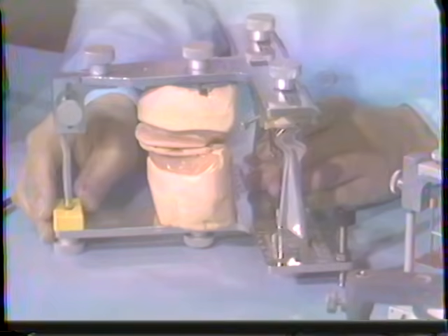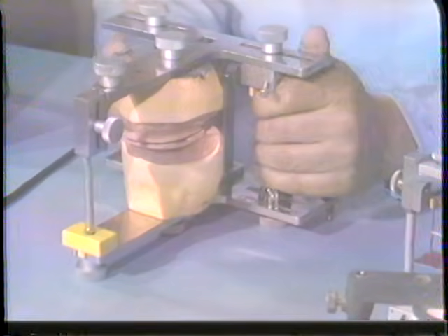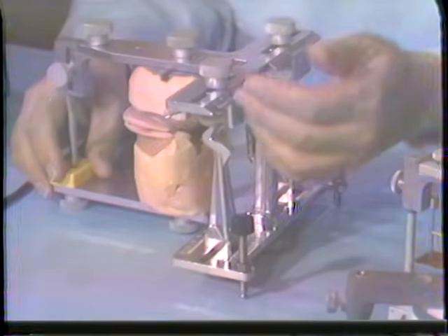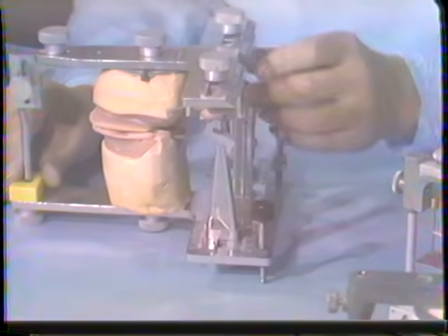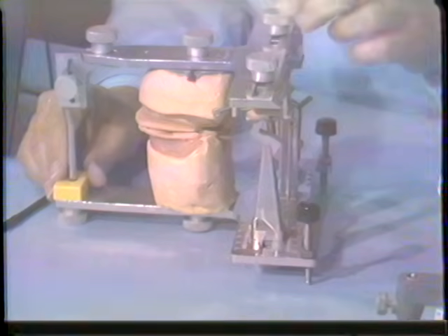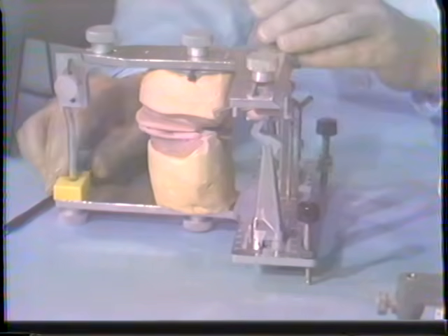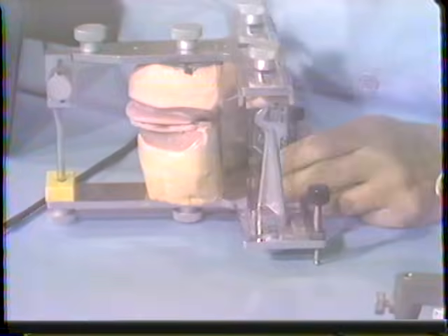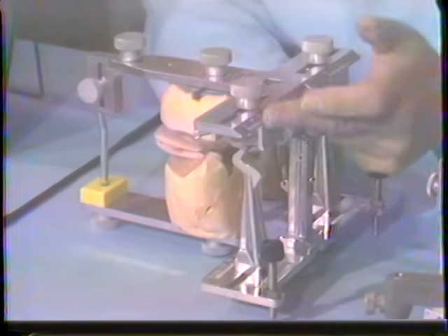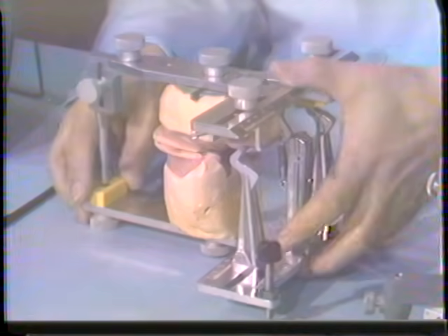Perhaps not better than with a pantograph record. The two are quite correlated to each other. But because actual guiding factors are reproduced in these elements on each side, this is called a stereographic procedure, stereographic recording. The instrument is a TMJ instrument, which is a logical name really for the instrument because you're simulating the TMJ fossa in these elements on each side of the instrument.